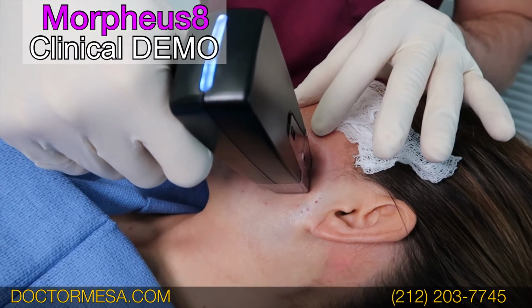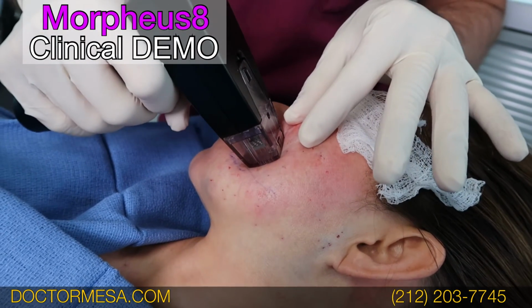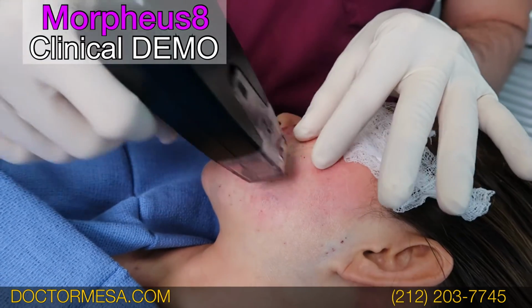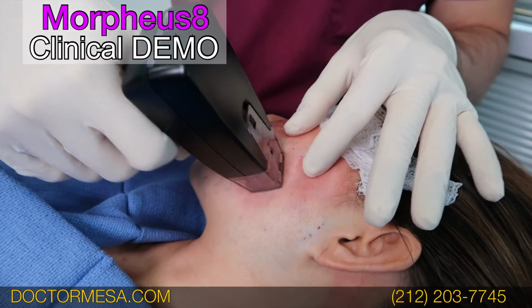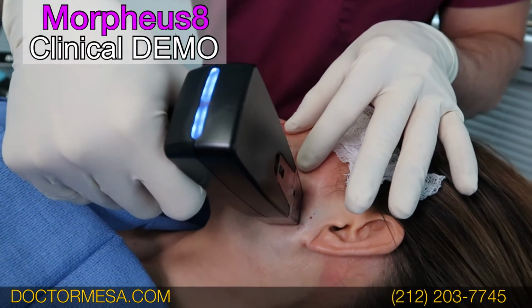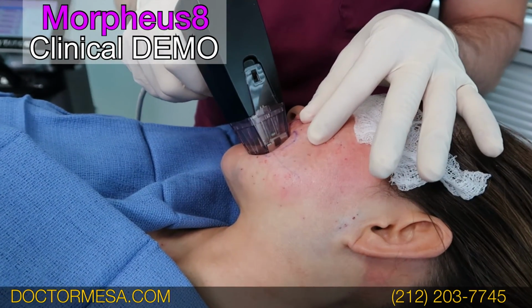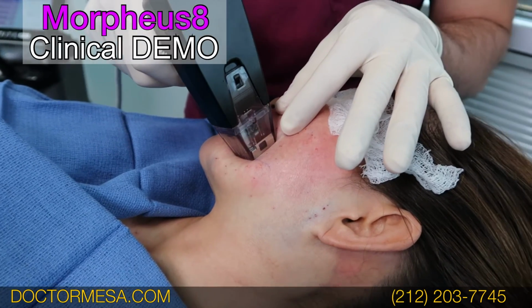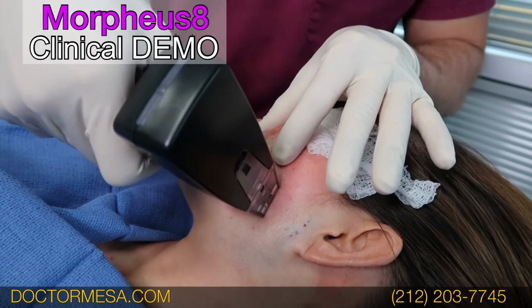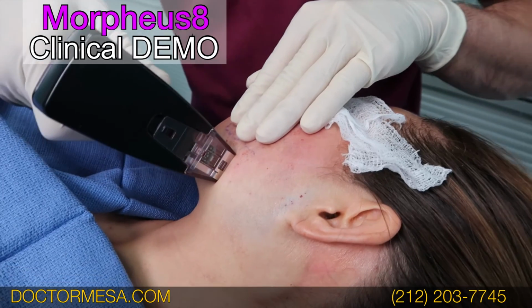Okay, so you see, we're treating all this area. Continue here. Excellent, so we're doing the mid face. So we continue doing the skin tightening. Any discomfort? No. Okay. Then we're going to continue here in the jawline.